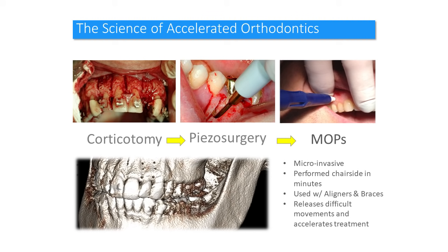Actually, what I found in my clinical experience is I'm getting a pretty good, if not almost the same, and maybe even better response with the Propel driver than what I was getting with the Wilckodontics. And I think the reason why is because of the way the corticotomy is made in the bone. In the upper Wilckodontics picture, we're using a high-speed handpiece and a small round burr.